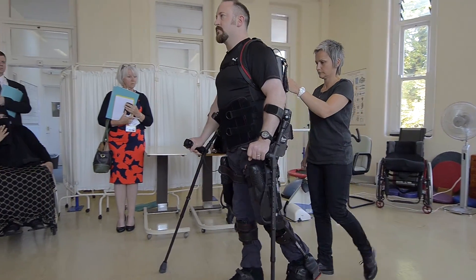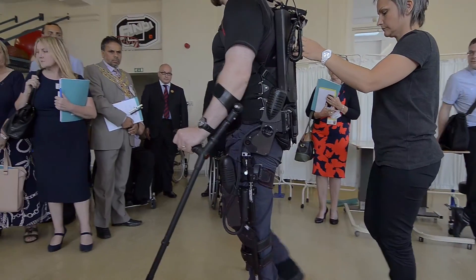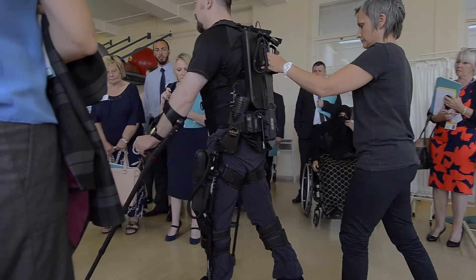You can see it's a really nice, smooth four-point reciprocal gait. We're getting a nice, constant, consistent heel strike, which is what we want to achieve.